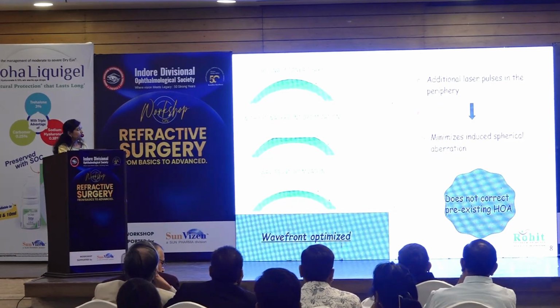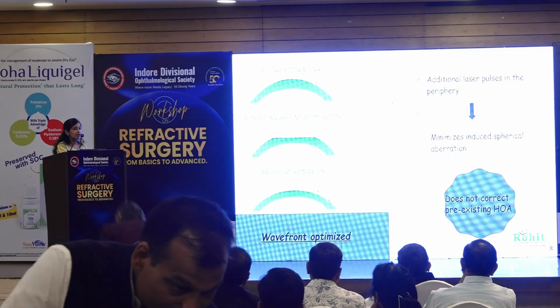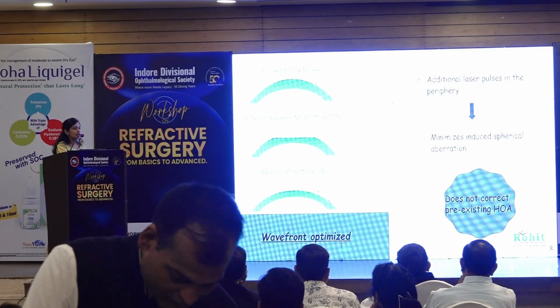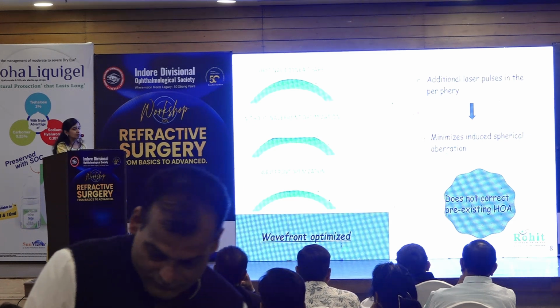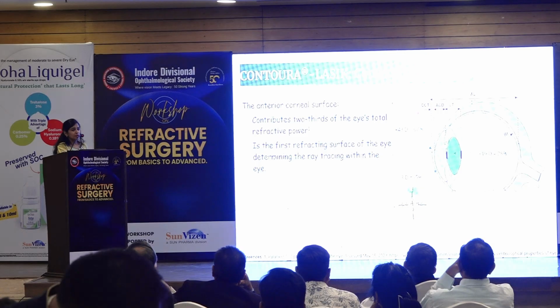Then came wavefront optimized, which actually did not correct the pre-existing aberrations but prevented induction of newer aberrations by giving additional laser pulses in the periphery. Then came the concept of Contoura.